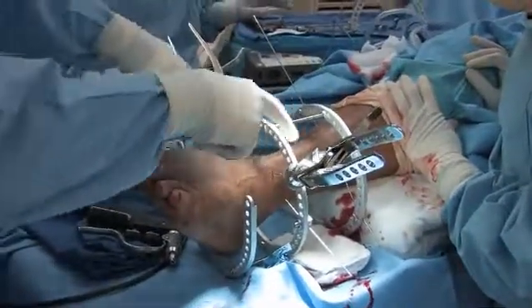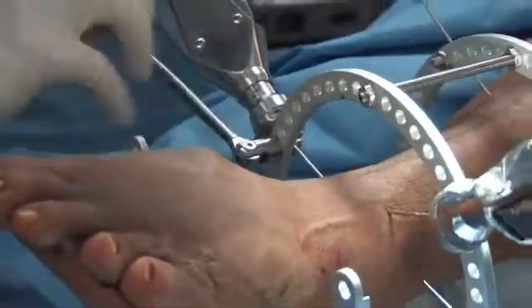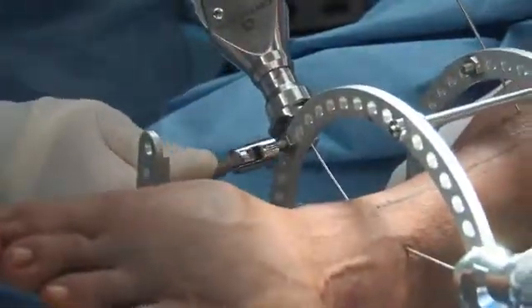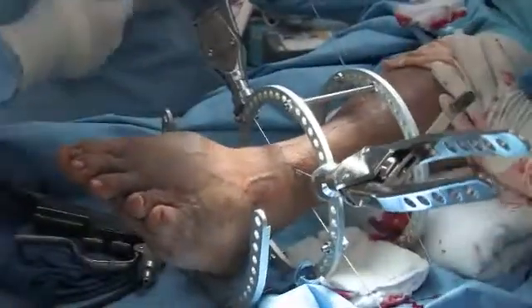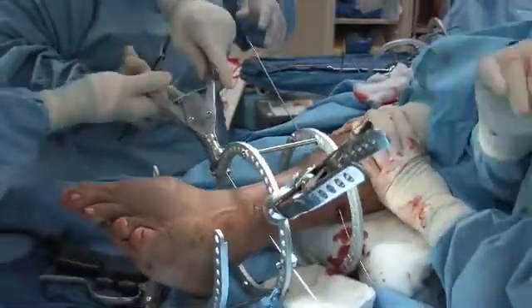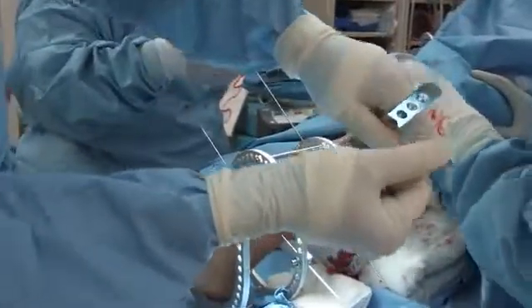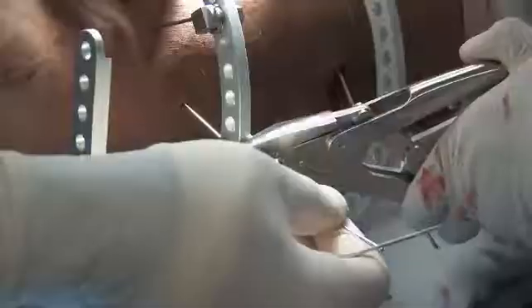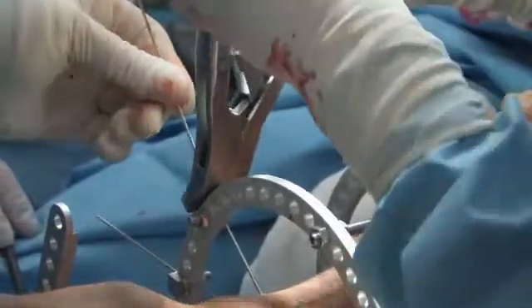So now we've got them at 130. We're going to go ahead and tighten these nuts. Okay. And to release them, you just hold the handle, push that up, and then make sure you pull them all the way out, and they'll come right off. So we'll go ahead and cut those 4 wires now that have been tightened and tensioned. Try and cut them as flush as we can. That way there's less irritation to the adjacent leg and clothes when they're trying to get dressed.